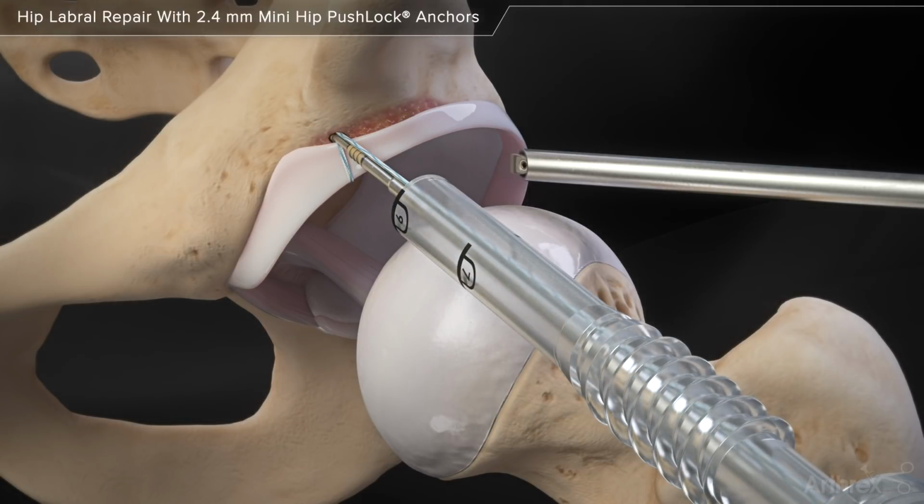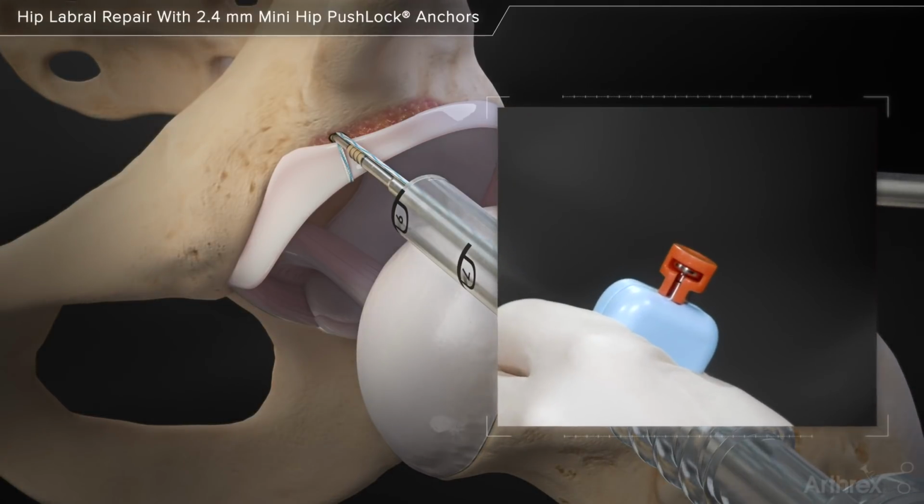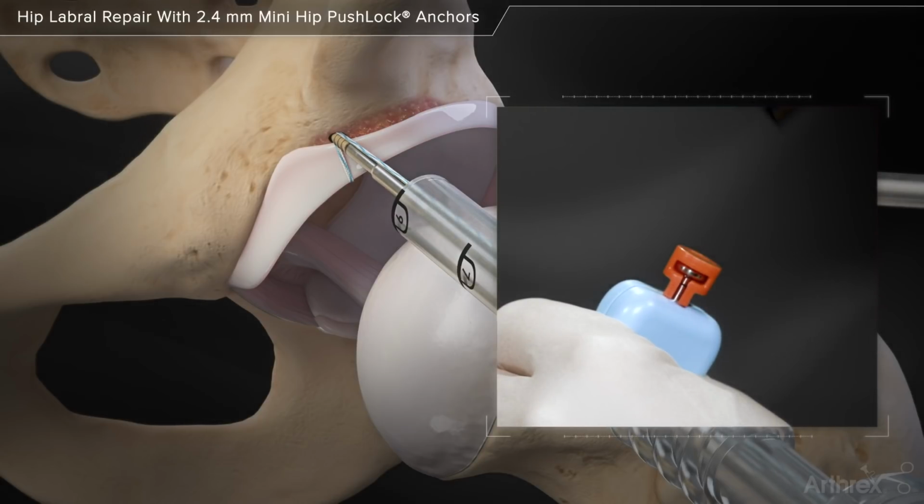The driver is advanced into the bone socket and the suture limbs are released. The orange cap is impacted with a mallet to bury the eyelet to the bottom of the bone socket and additional tension is pulled if needed.